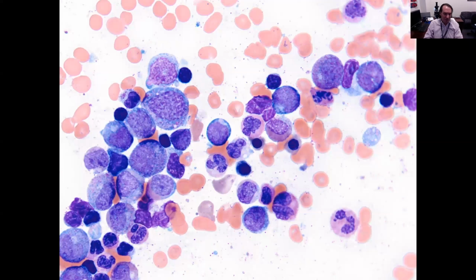Here's the marrow from this patient, which is actually subtly abnormal, but not terribly abnormal. You can see there's dysplastic appearing granulocytes. There's immaturity here.